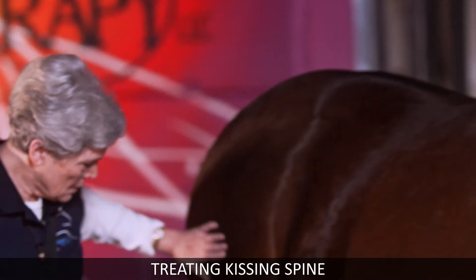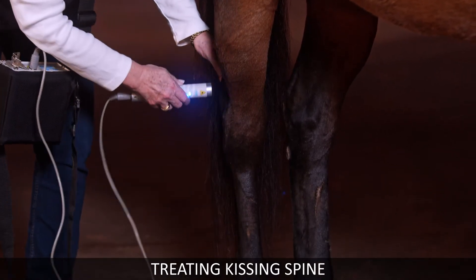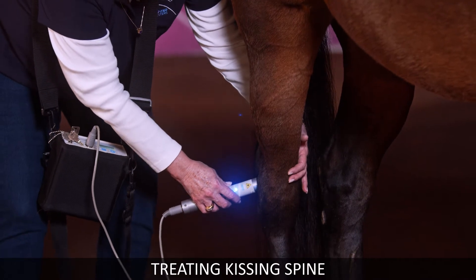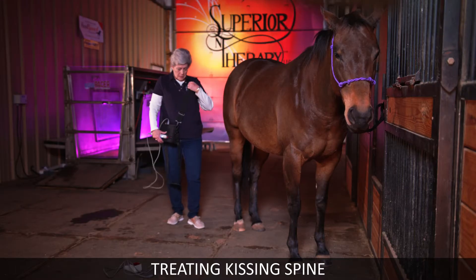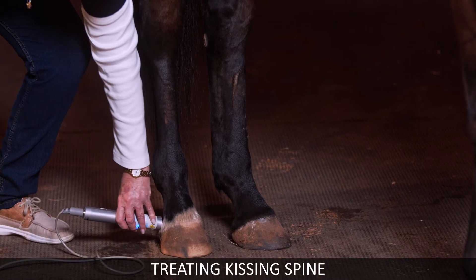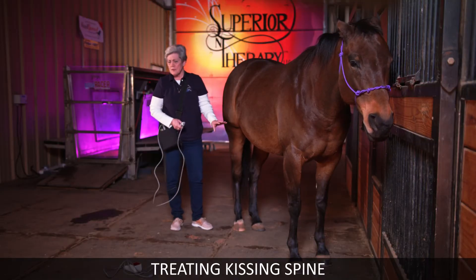Come down to the hock and treat the front in three places, then treat the side — leave it at least two beeps in each place. Do the same thing on the inside, and also get once down the front. On the feet, treat around the coronet band with the laser pointed down. Use it on the feet and also get it back here in the back. Leave it an extra beep in the back. You'll use this for abscesses, sore feet, and founder.